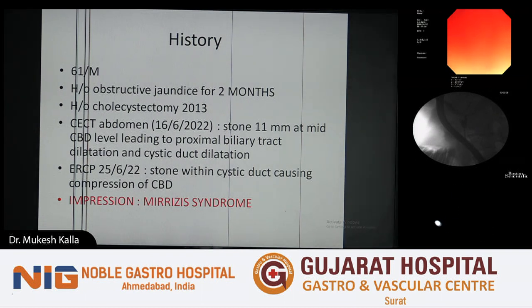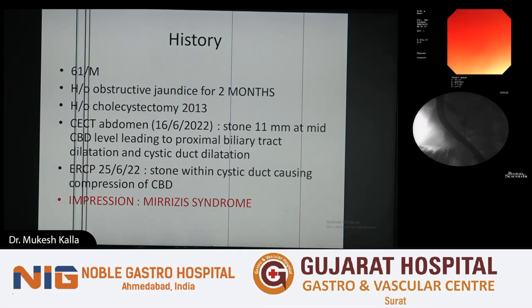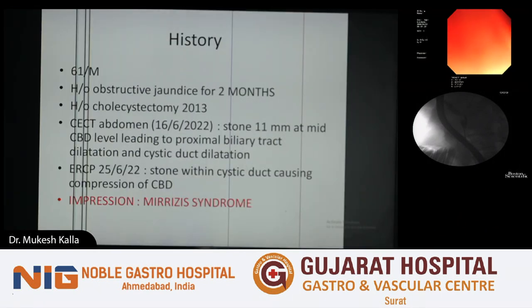Sir, to conclude the session, I just want to say one thing. In the last 6 months to 1 year in Civil Hospital, in our unit, we have explored the CBD in maybe around 15 cases. These are cases where we failed ERCP 2 to 3 times. You are saying it is not seen in the last 5 years, but we have done it after failed ERCP 2 to 3 times. So it is an indication. Maybe patients are not affording spyglass or the like. But it has a role, it should be done, and it is a very safe procedure.